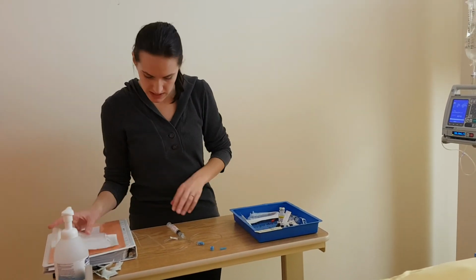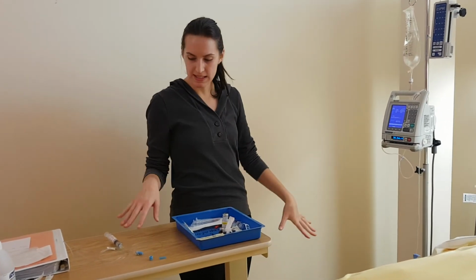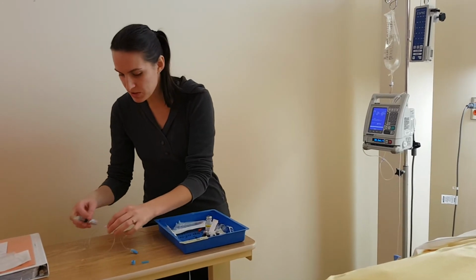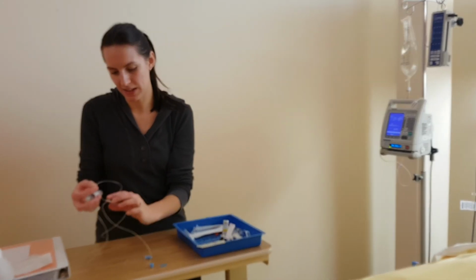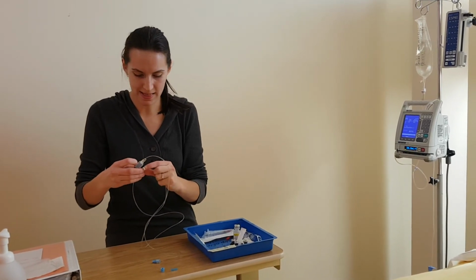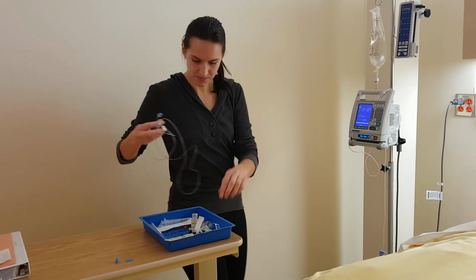So I'm going to the bedside, like I did. I'm going to begin by connecting my CIVA to their IV site. So I'm just going to close my clamp here, just in case I do accidentally press the syringe, so that they don't get the medication at the incorrect rate.